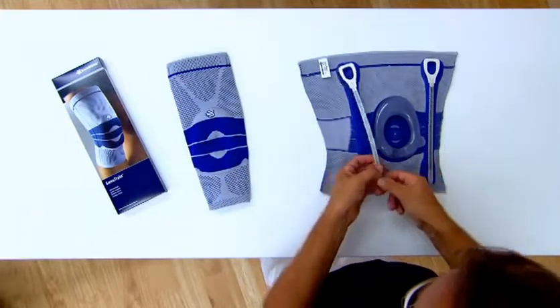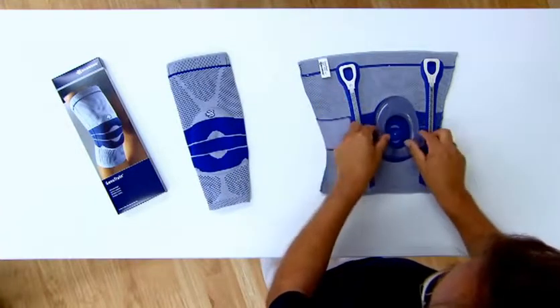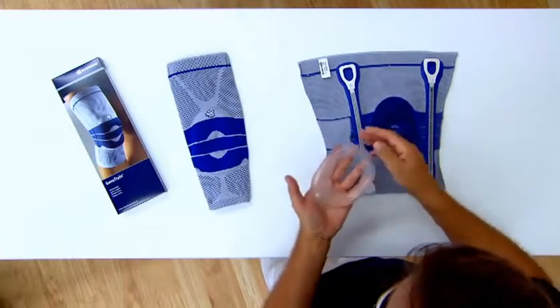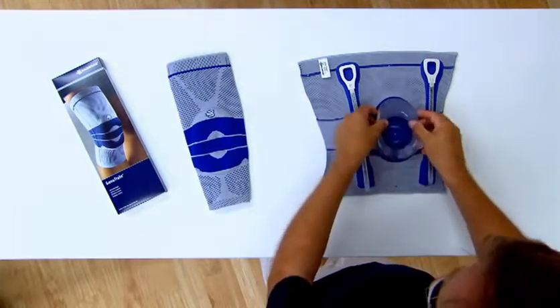Two spiral stays with donning aids are incorporated into the sides of the knee support. The patented Omega Pad with lateral meniscus wings and HOFA pads encloses the kneecap and helps to reduce pain.